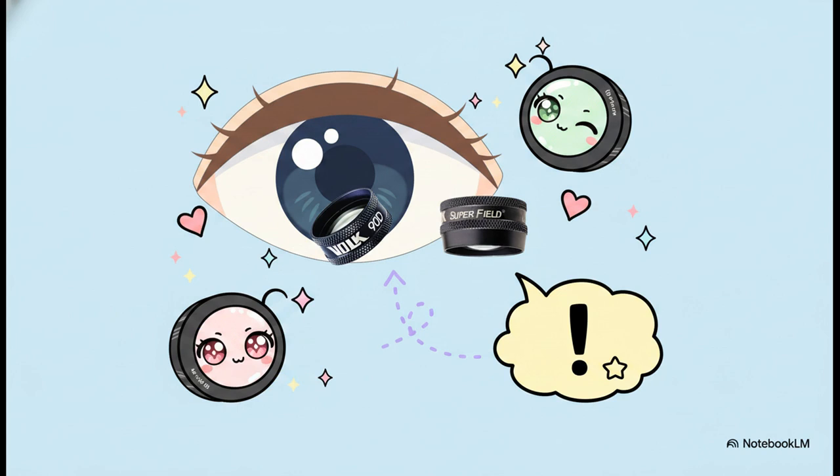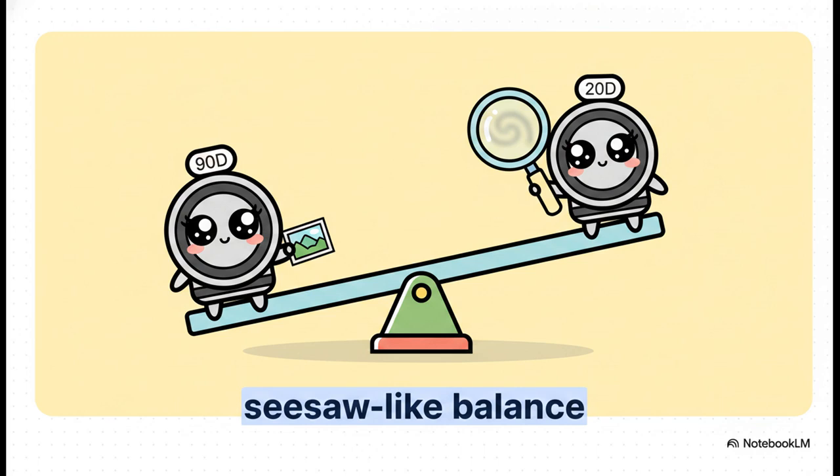But hey, here is a massive pro tip. Always, always make sure the lettering on the bottom of the lens faces the patient. The V on the Volk lens should be pointing right towards the patient's eye. If it's not, your optics are going to be totally distorted, and nobody wants that. It's all about optics here.